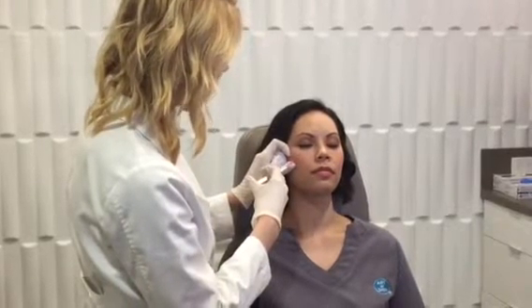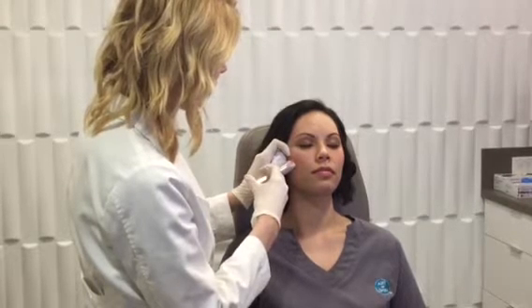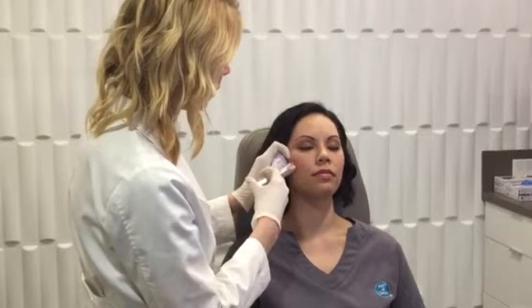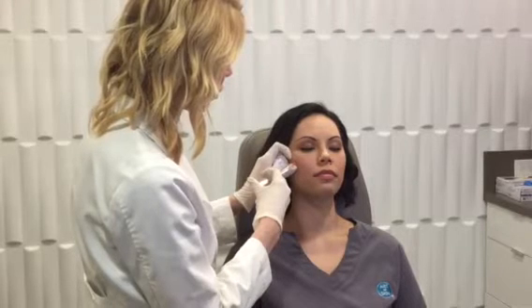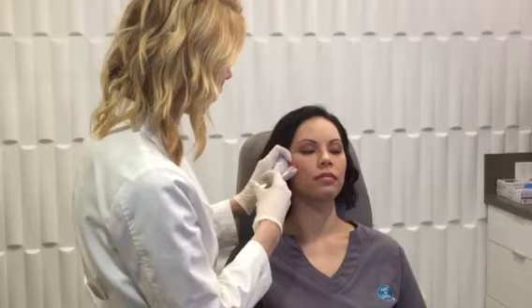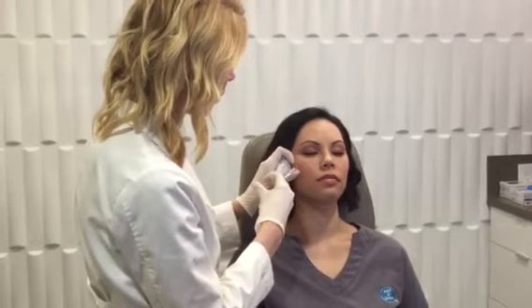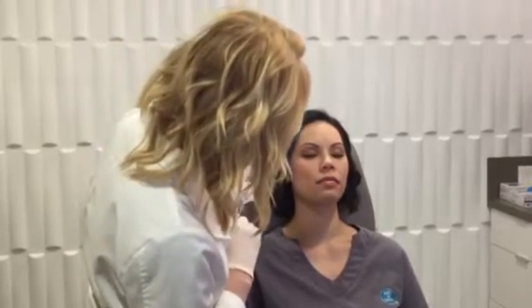And it's actually got numbing pre-incorporated into the Restylane Lyft. It goes in really smoothly. It's a particulate gel, and it typically lasts in most patients, I would say, 6 to 12 months. If we're doing more than 1 syringe, sometimes patients get a little bit longer out of it. But it's really easy to inject, and as you go along, because there's numbing pre-incorporated into the filler itself, it makes it even a little bit more comfortable for patients.